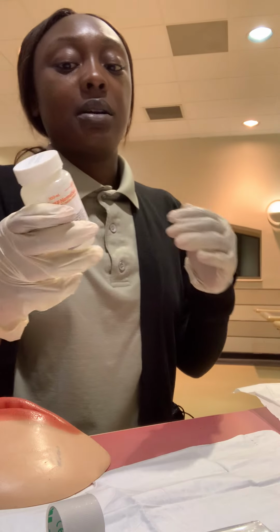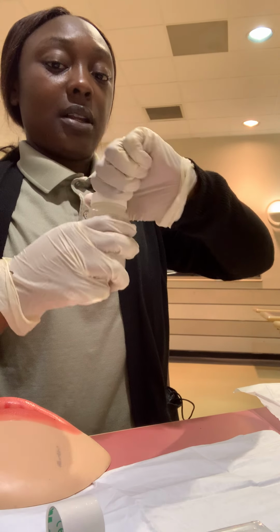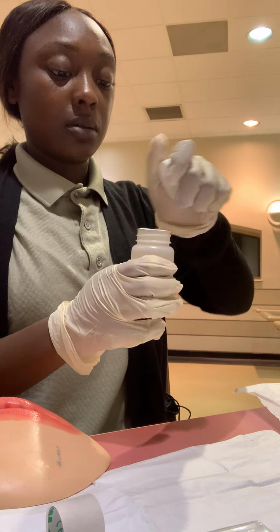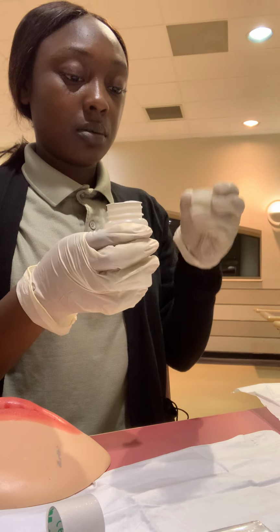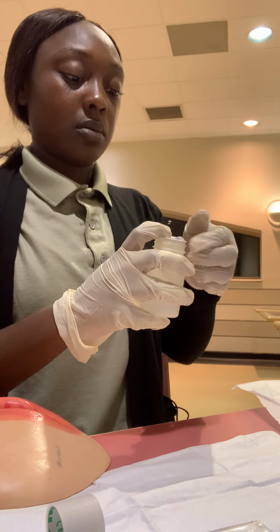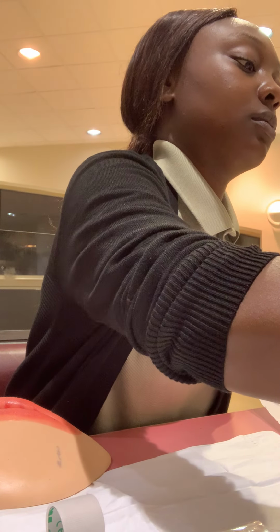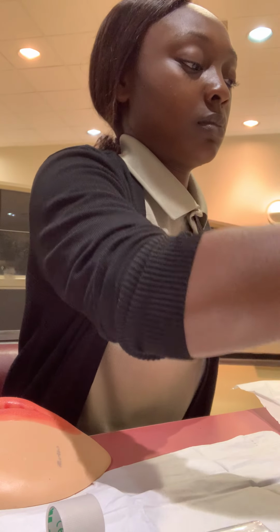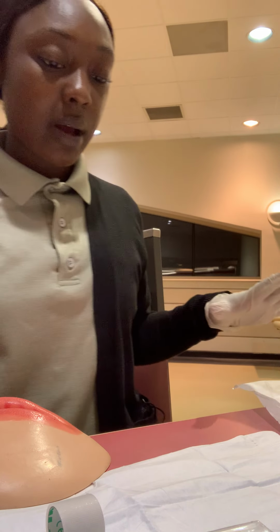I'm going to take my saline and pour it into my box. Saline has been poured into the box.